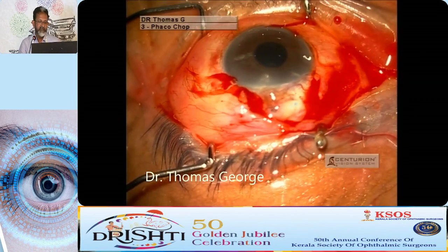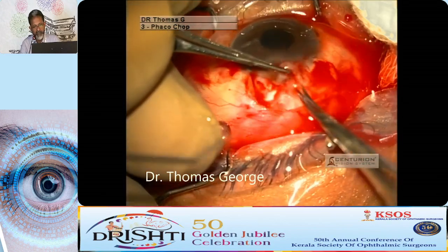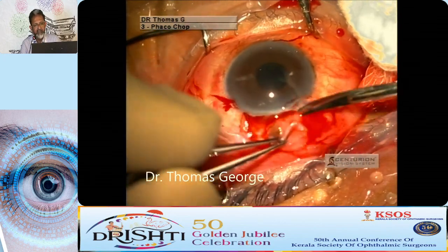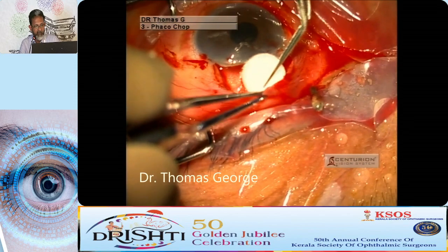I've speeded up this video a little bit. There's again a preferred path, which is why I can do quite a bit of the dissection with the sponge itself. And later on, I do a sharp dissection where it's still stuck. Once I've excised the bleb, make sure the conjunctiva can reach up to the limbus for a watertight closure.